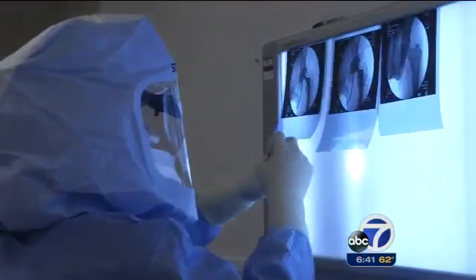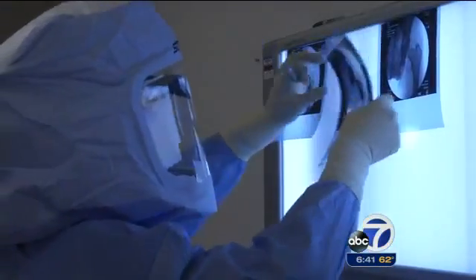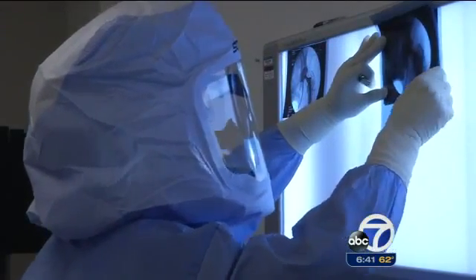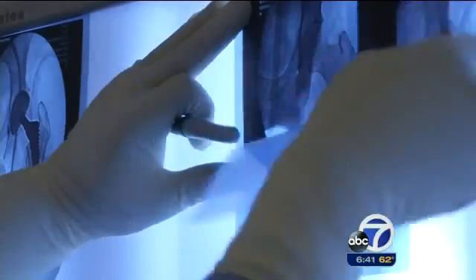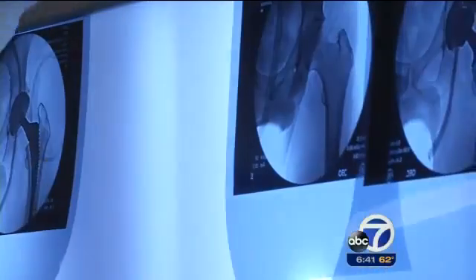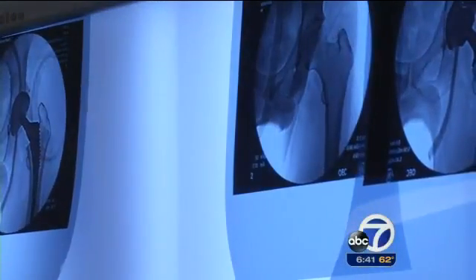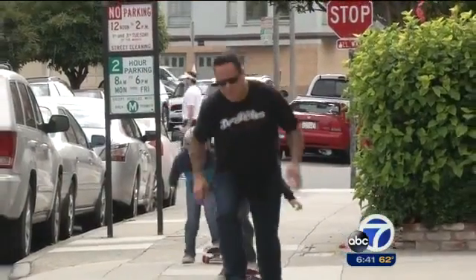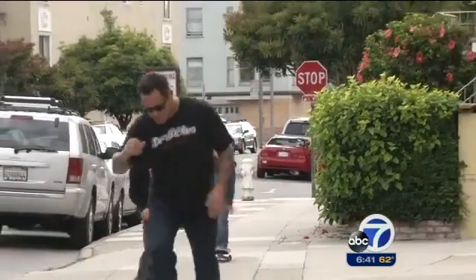After implanting the ball and joint, Dr. Mast compares the placement to images taken before the procedure. So we've got a pretty good reproduction of his normal geometry of the hip. Supporters say the technique can shave several weeks off of recovery time. Hank was back home 2 days after his double hip replacement, and he's now 7 months into his recovery.